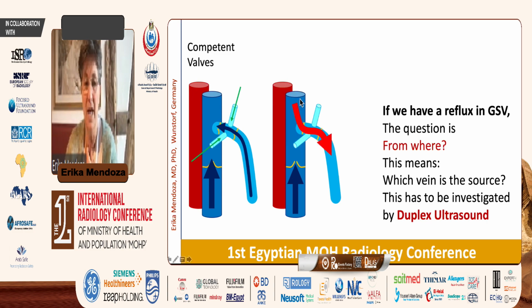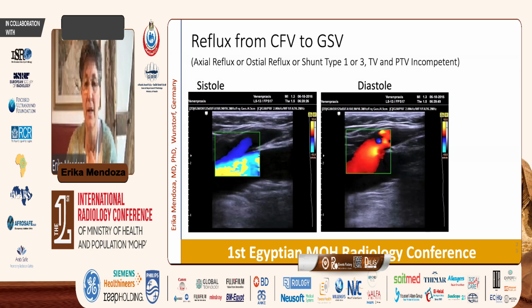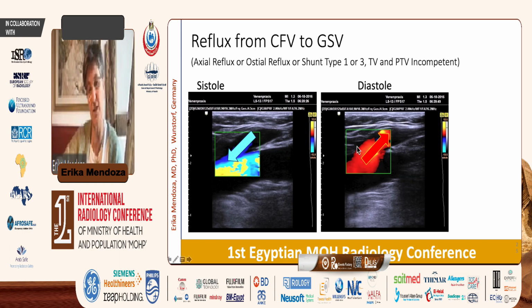Most often it is a so-called axial reflux, and it comes from the deep vein, crossing both incompetent valves and going down the great saphenous vein. This is so-called axial reflux, and the terminal and preterminal valves are incompetent. In ultrasound, this is a longitudinal scan. We see the femoral vein, and the great saphenous vein in the groin entering the deep vein. We have an anterograde flow if you compress, if the patient puts up the toe. And when we decompress, or the toe goes down, we have a reflux from the deep vein through the terminal valve, through the preterminal valve here, out into the leg.